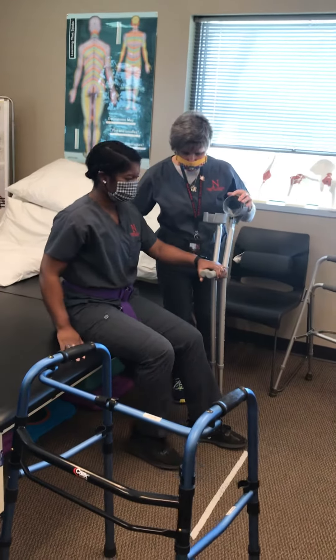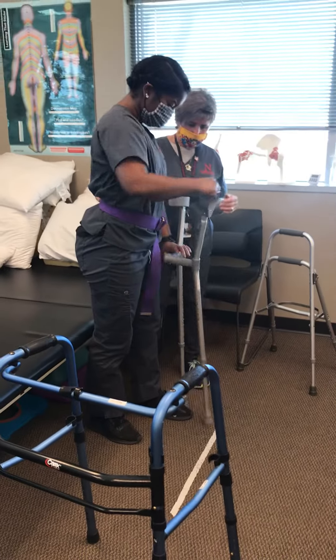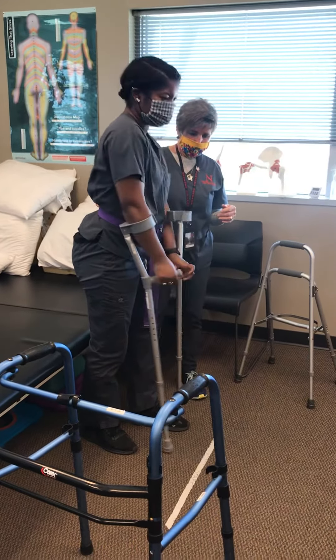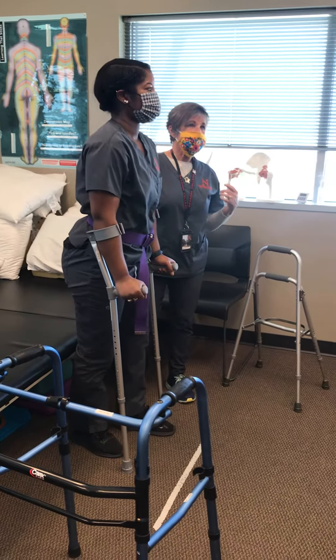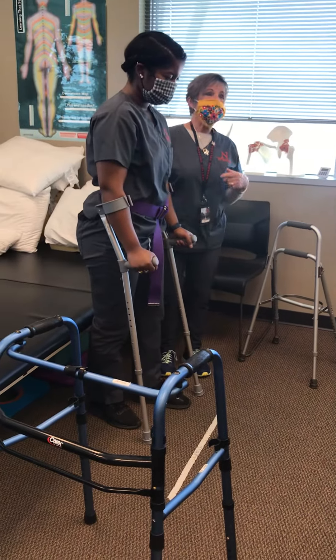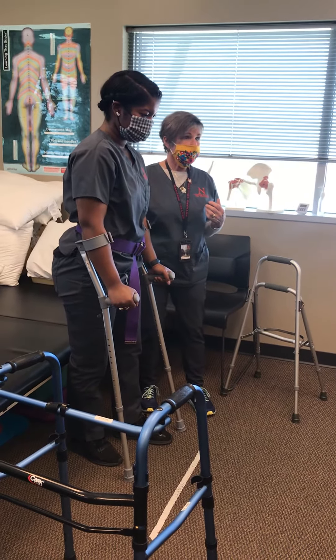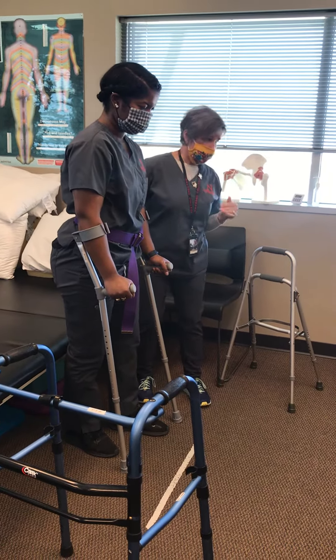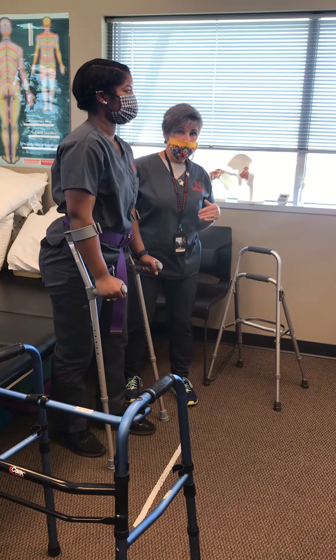We'll do it again. This is not a stand-to-pivot. This is the patient that is ambulatory and we want to continue to foster weight shifting with this patient. We never ever want a patient that's had surgery on a lower extremity to pivot on that lower extremity.